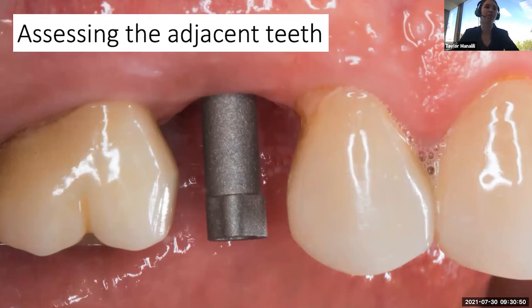Having a 3D visual representation of the patient's mouth chairside with you is so helpful. Whenever I'm doing these single unit or multiple unit restorations tooth-borne, one of the biggest advantages for an implant restoration is having nice broad contacts.